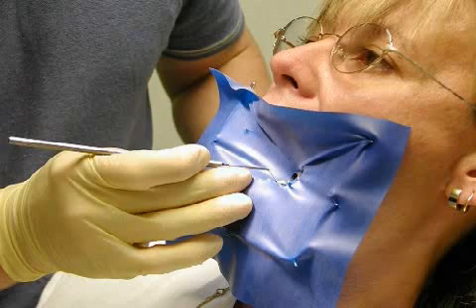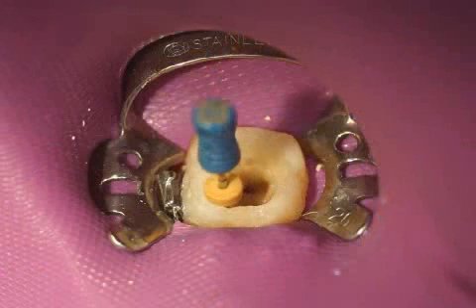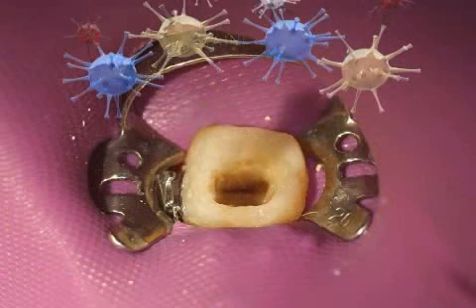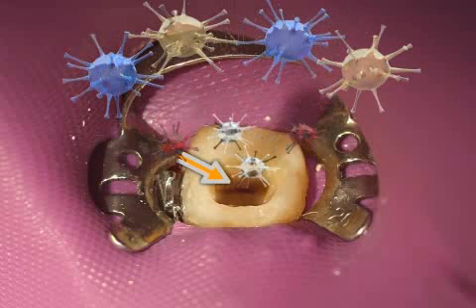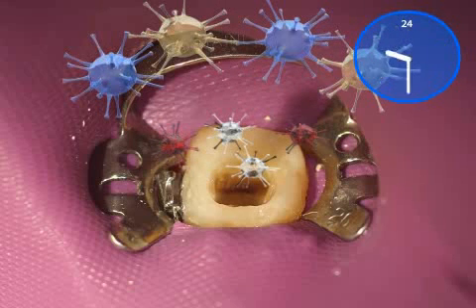Root canal treatments should never be performed without a dental dam because there are many bacteria in the saliva which can trigger infections. By making their way inside the open tooth canal, the bacteria can multiply without hindrance in the interior of the tooth and cause infections in the bone after weeks, months, or even years, frequently leading to the loss of the tooth.